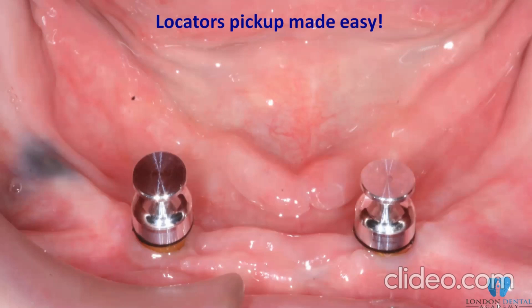The reason I want you to stay away from the more specific ones and stay with the more generic is because of the patient's maintenance. If you treat some people and you are not available in the practice, or they move somewhere else, there is access to different or interchangeable components. So keep it standard if you can.